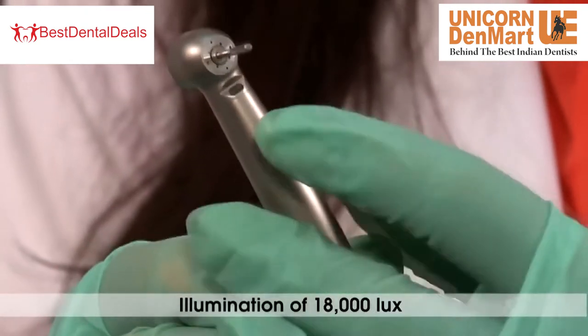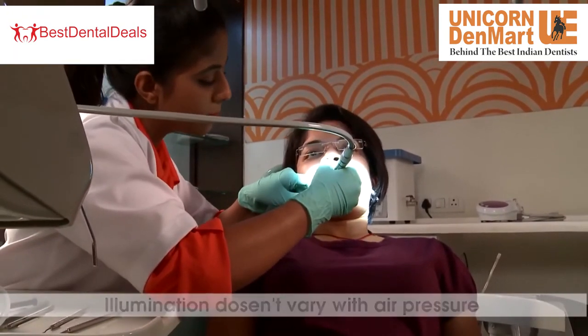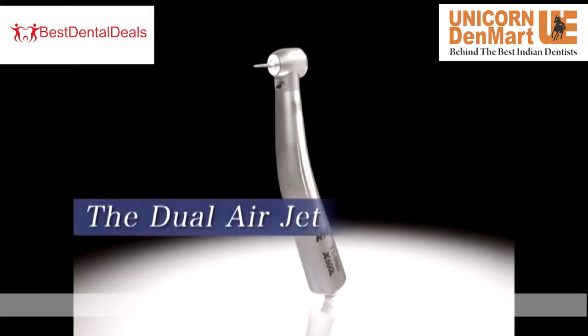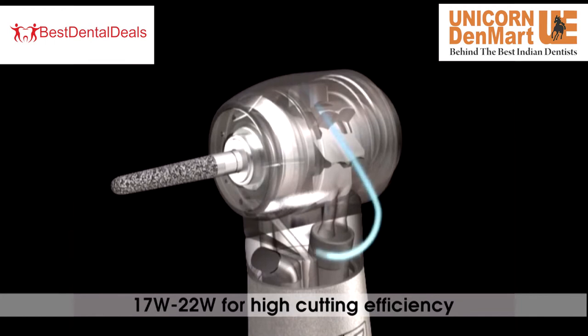It provides illumination of 18,000 lux which does not vary with air pressure when a continuous DC voltage of 3V is supplied, activating the dynamo and the PCB controls. Dual air jet provides 17W to 22W for higher cutting efficiency during dental procedures.